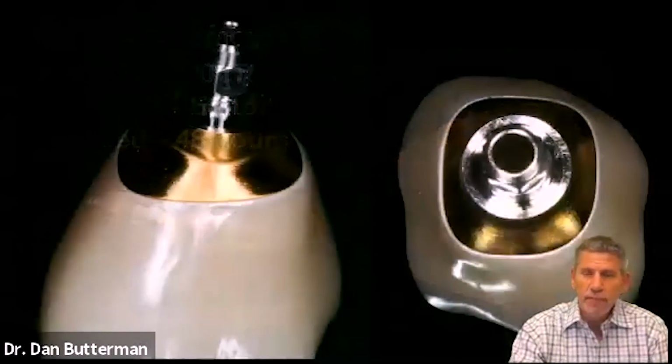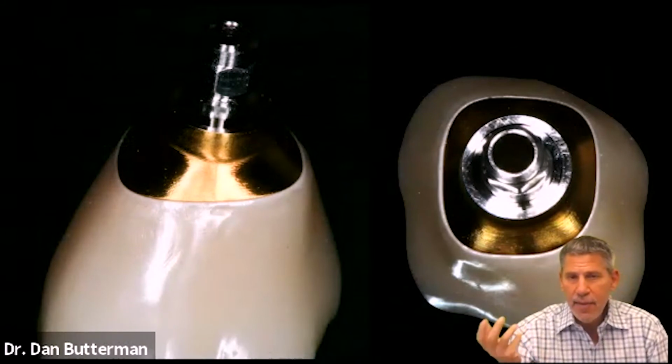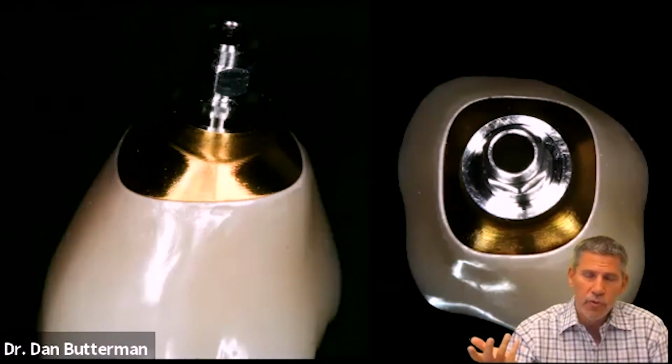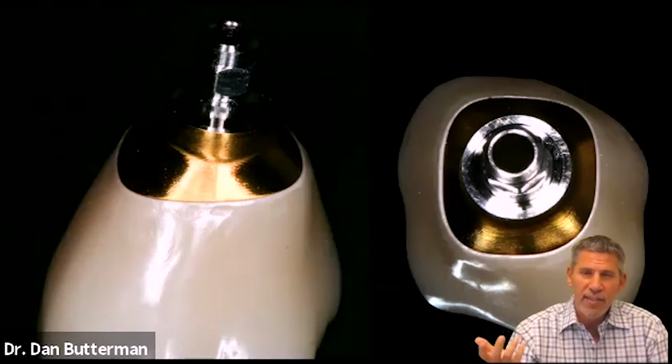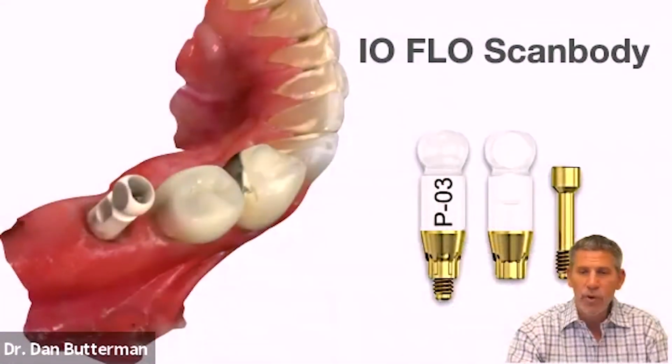So what blows me away every single time is I made this crown before the abutment was ever created. I made this crown off of that virtual core file, and the fit is just insane. It's just perfect because we're dealing with virtual digital files, and they work incredibly well.